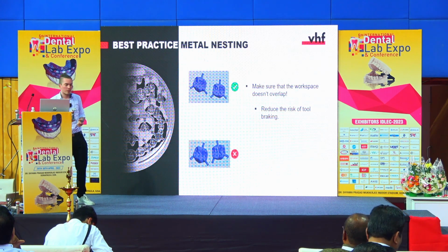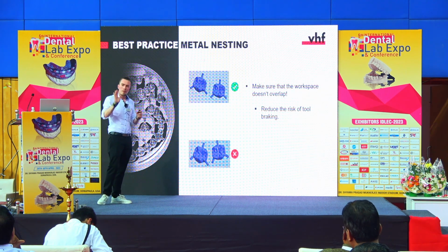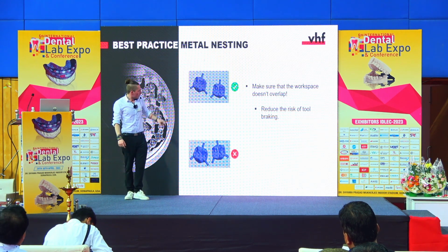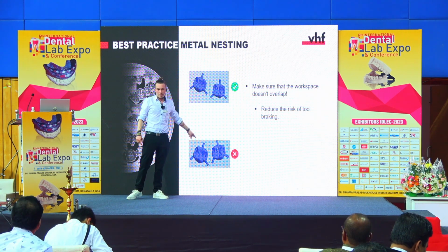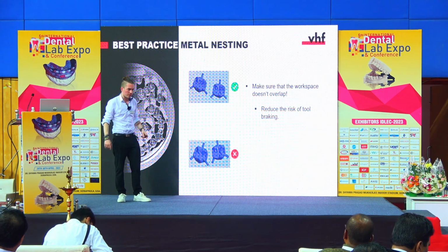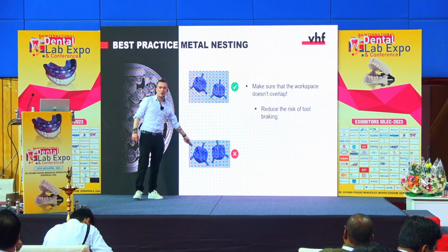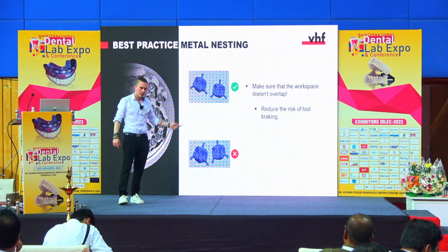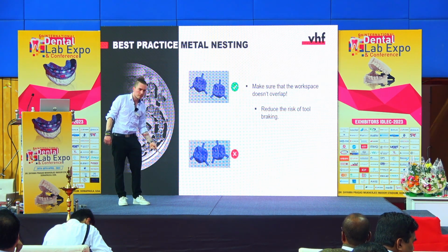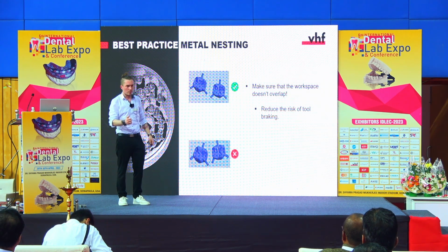Also a point that is important when it comes to metal milling or hard materials, this is not for zirconia or PMMA, but very crucial, and a small tip when it comes to metal milling: look that your workspaces are not overlapping. And why? For zirconia, this is working super fine, you can save space, but not for hard materials. When this object is gone, there's air. And so every time the tool goes around the second object, it will go from the material into the air, and then back into the material, and then into the air again. And every time it goes back into the material, you get a little punch on the drill.